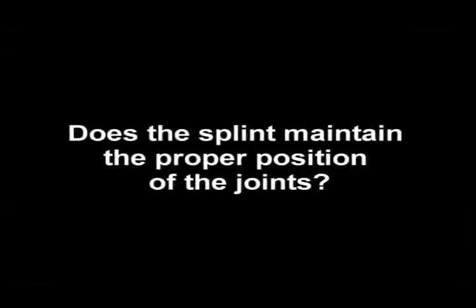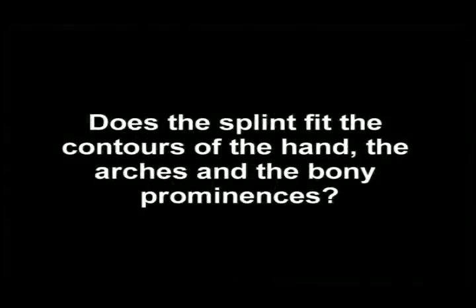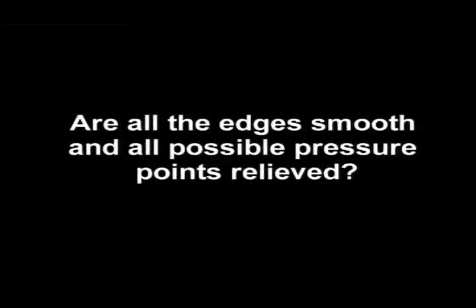Use the following questions as a guideline as you complete a final assessment of your splint. Does the splint achieve its purpose? Does the splint maintain the proper position of the joints? Does the splint fit the contours of the hand, the arches, and the bony prominences? Does the splint restrict or immobilize only the joints it is intended to immobilize? Are all edges smooth and all possible pressure points relieved? Can the patient apply and remove the splint? Is the splint cosmetically acceptable to the patient?